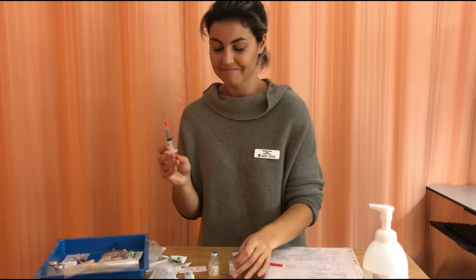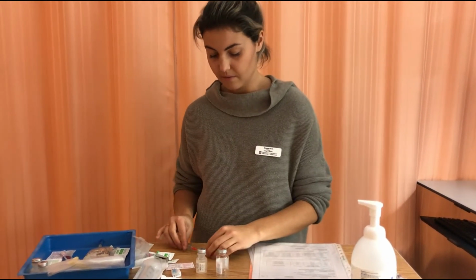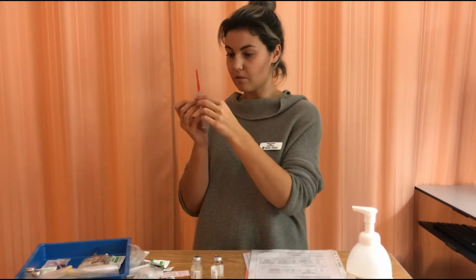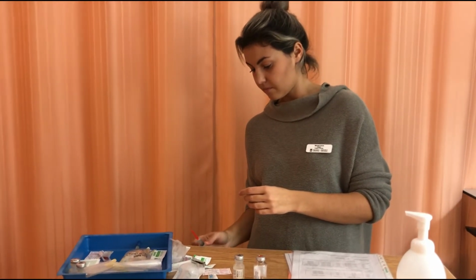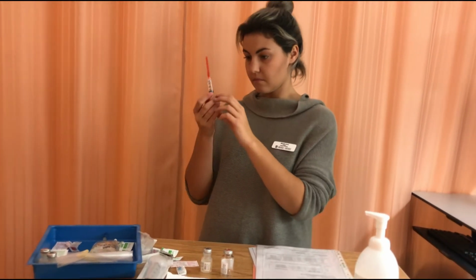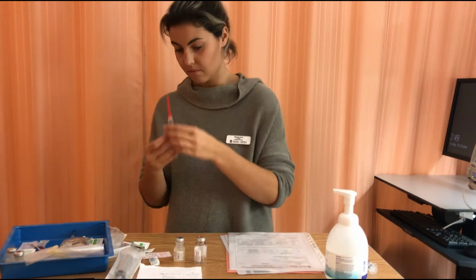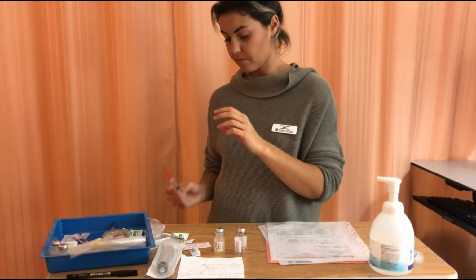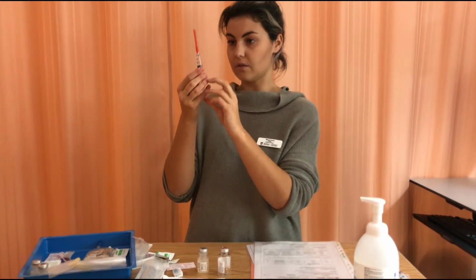So now I'll do my second check. I'm going to be demonstrating tapping. Right drug, making sure there's no bubbles in there. Compared my mark, drug is right, and the right dose is 1 gram, route is IV, and frequency is every 6 hours, which is now. So our patient is Emma Wrightson. Okay. She is allergic to morphine. Again, I would be doing this over the sink, okay?